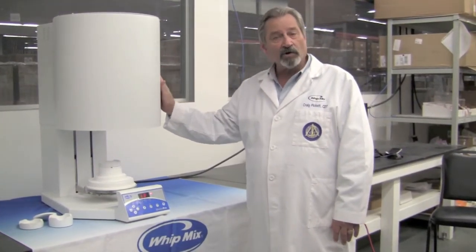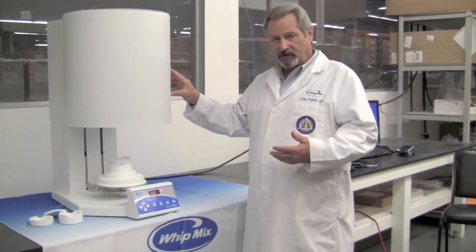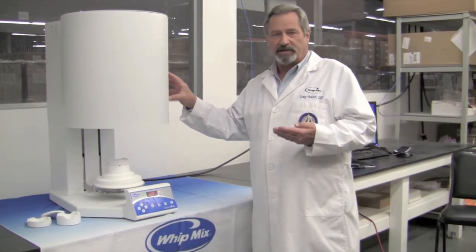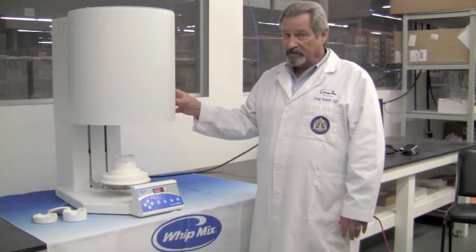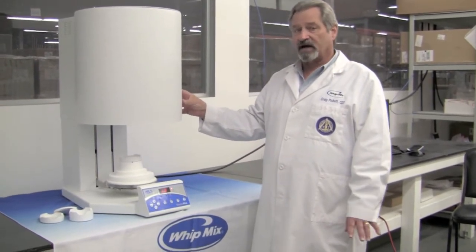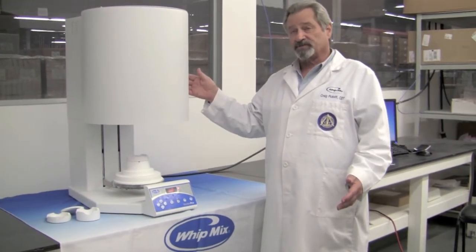It does have a power fail recovery system, so that if it's in the middle of a sintering program and your power goes out, it will restart the program at that point and continue to the end. It is a UL safety certified machine. You'll find that many of the sintering furnaces on the market today are not UL safety certified, so you might take that into consideration when you are purchasing one of these machines.